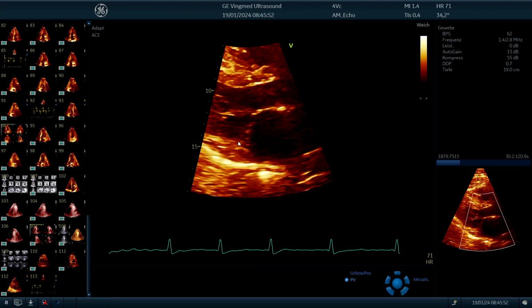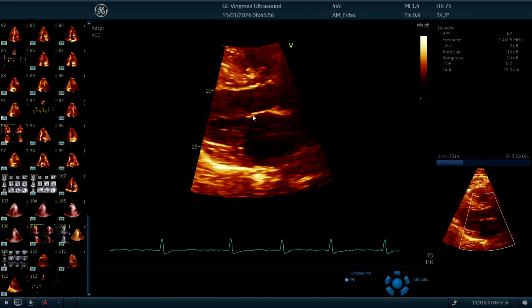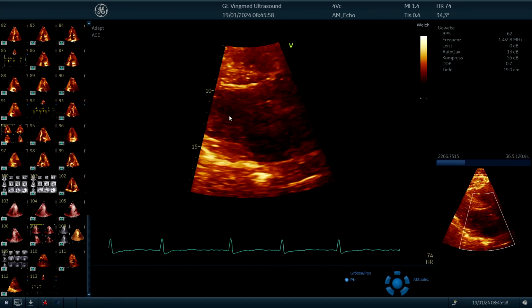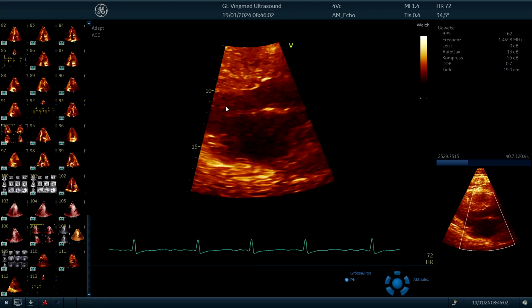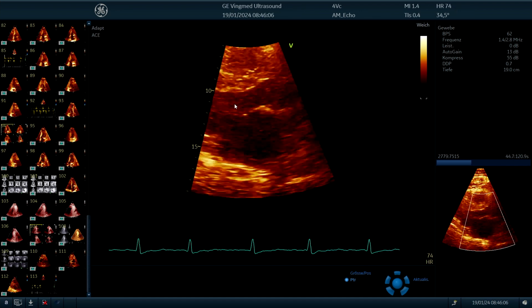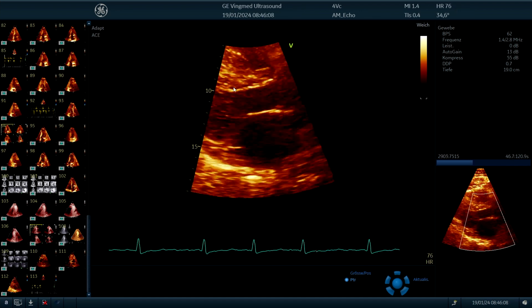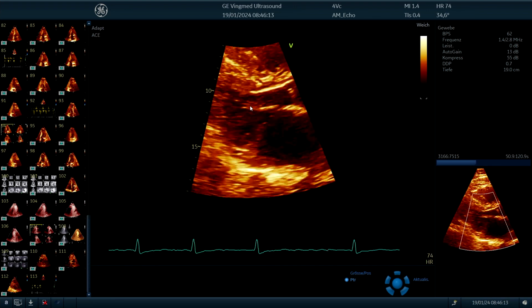There is atrial fibrillation present, most likely; we do see it in the ECG we have, and also in how the overall heart and contraction is moving. And we do see one interesting finding. So here this is the anterior mitral valve leaflet, and in the case of a thickened myocardium, we have to look for a SAM, the so-called systolic anterior motion of the mitral valve.